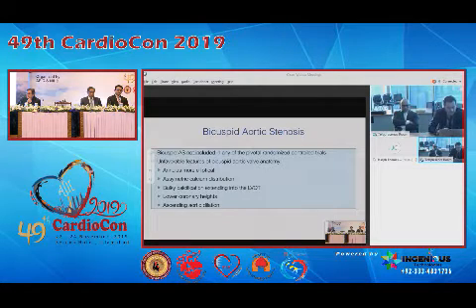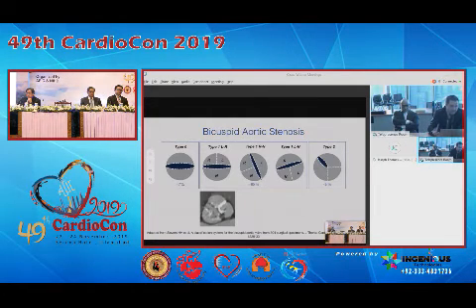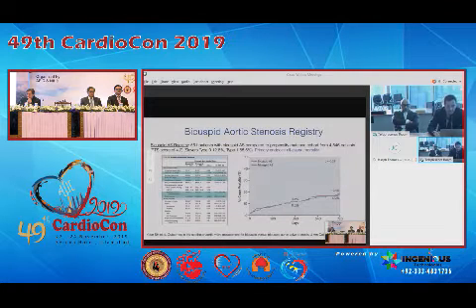And so if you talk about bicuspid aortic stenosis, why is this unfavorable for TAVR? The annulus is more elliptical, there's often asymmetric calcium distribution, bulky calcification in the LVOT, and several other issues that make bicuspid aortic stenosis difficult. We all understand the Sievers classifications, but there's variability in how each one of these patients presents and which ones are actually candidates for TAVR or not. But just to say, there is no randomized data for bicuspid aortic stenosis. We only have registry data for this group of patients.